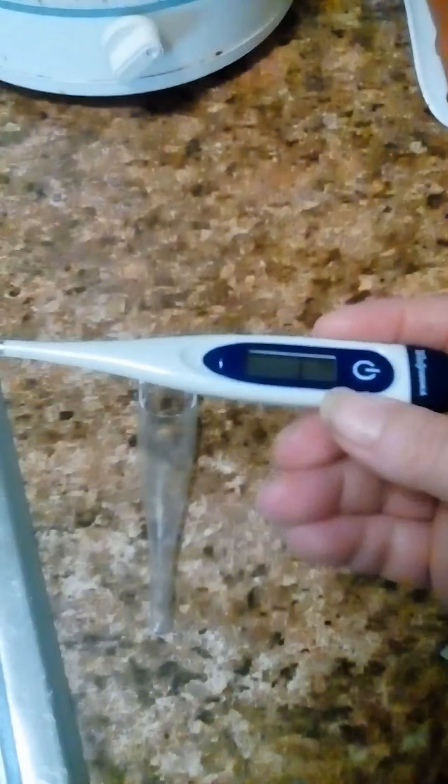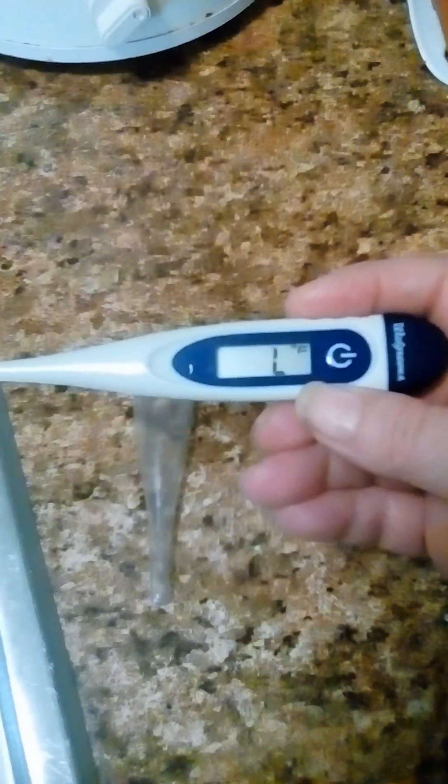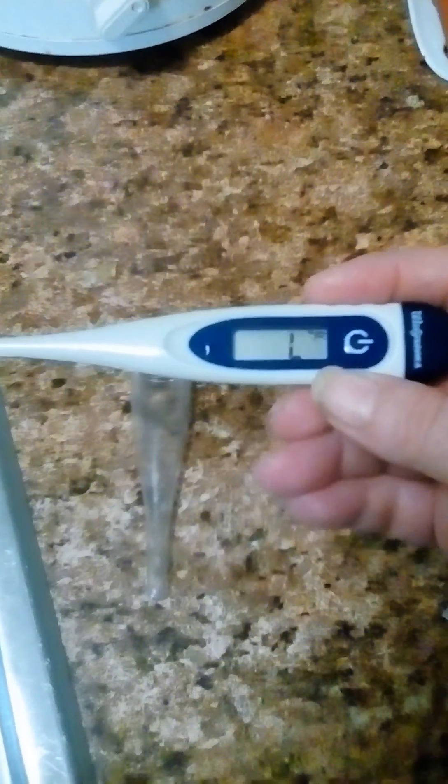I just got sick a couple of weeks ago. I was sick to my stomach for a couple of days, and I was using this to make sure if I was running a fever or not. It did a pretty good job.